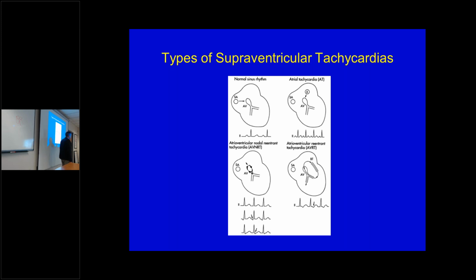because even with a tachycardia, the ventricular rate can only max out so high, and it has to repolarize, right? So there'll still be a time in the ST segment where you might get an inverted P wave and be able to recognize it. But in this case, do you think that that's the only P wave going on? Probably not. You probably have P waves in the QRS, and the P waves are going along. You're just not seeing all of them. You're only seeing them when you get a firing of the ventricle.